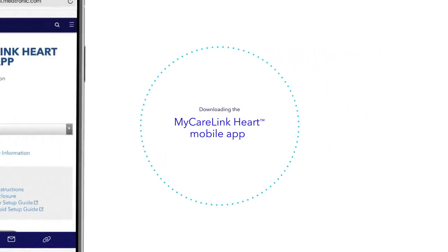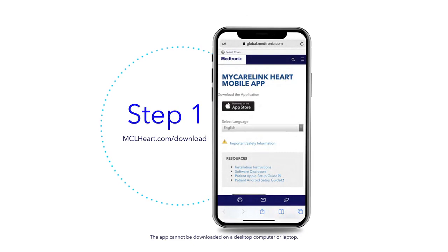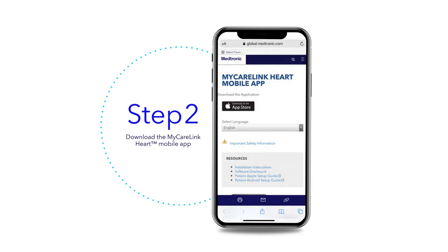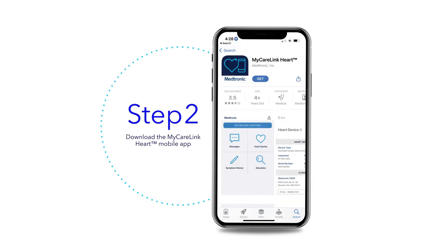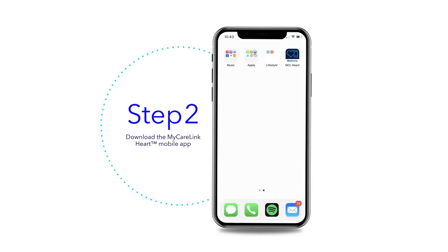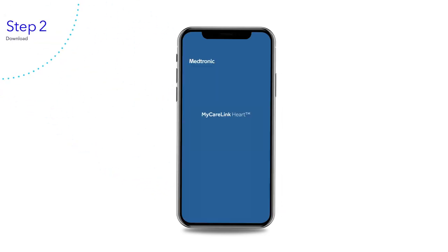Visit mclheart.com/download to download the MyCareLink heart mobile app. You will be directed to the App Store or Google Play Store. If your smartphone or tablet is compatible, you can tap to download the app. Once downloaded, open the app to launch MyCareLink heart and start the setup process.